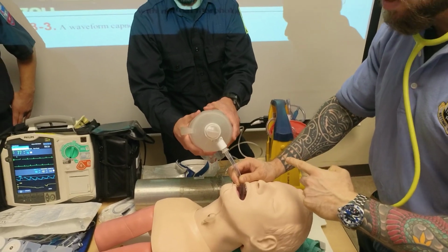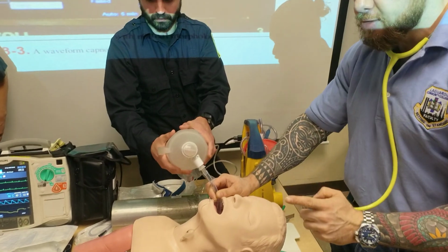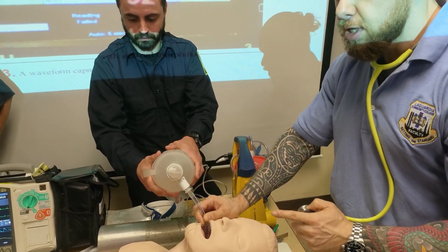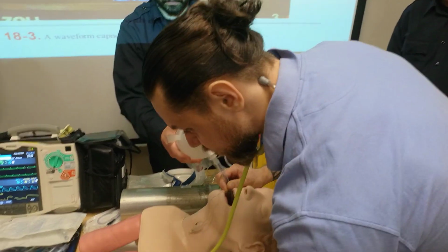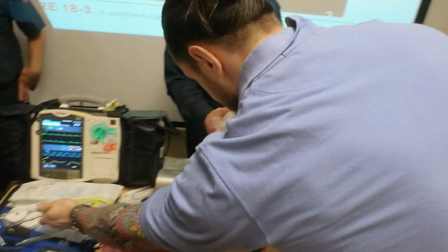When I confirm, I want to do it quickly. Breath, breath. Breath, breath, right? Positive lung sounds bilaterally. Did I go too deep? No. If I was too deep, I will what? Deflate, pull back, reinflate, reassess. Squeeze, squeeze, right? Very good. Did I confirm?